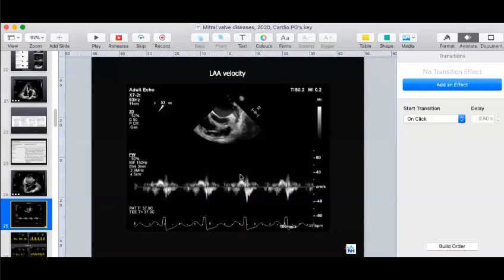So when do we say that it is normal? Sir, emptying velocity is 50 to 100 centimeter per second, sir. Okay, somewhere around 40, 50, depending on which literature you source. So I generally take it as 40 to 50. Anything less than 40, definitely it is reduced. Anything less than 20, in this particular patient you can see that this is the 20th mark and it is really bad here. So this is significantly, severely reduced. The cutoff value which you should remember is around 40 to 50. So that would be the emptying velocity. And this is the filling velocity, which we are not really concerned about.